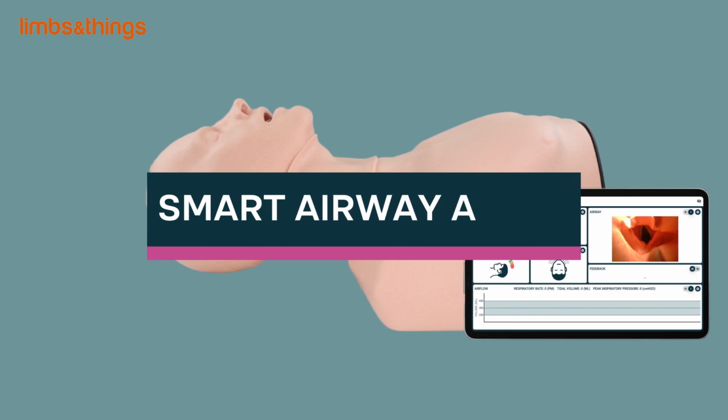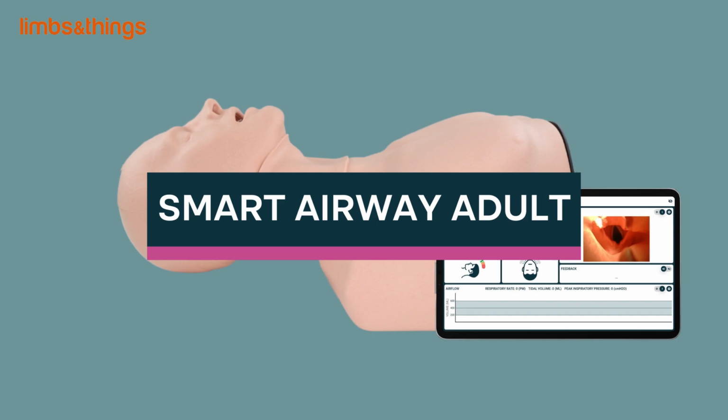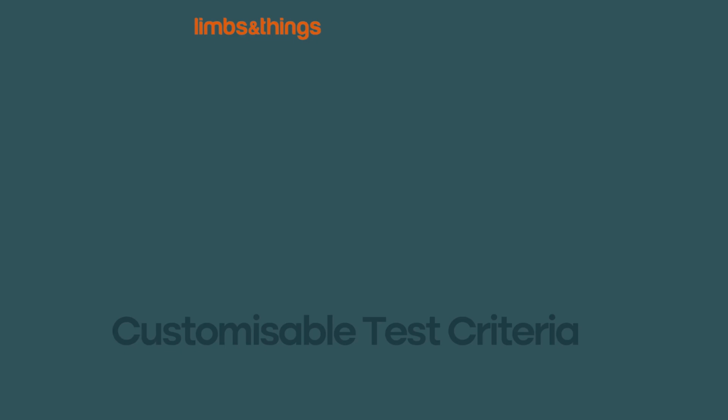The Smart Airway Adult incorporates smart features and sensor technologies to provide real-time feedback to users training in airway management. The Smart Airway app includes 3 training modes.